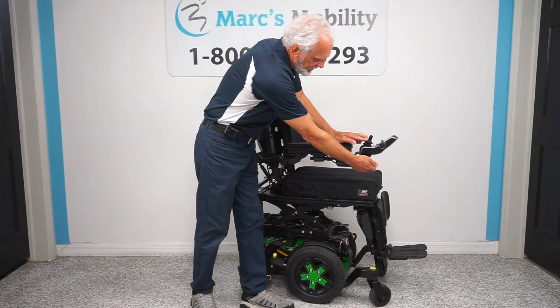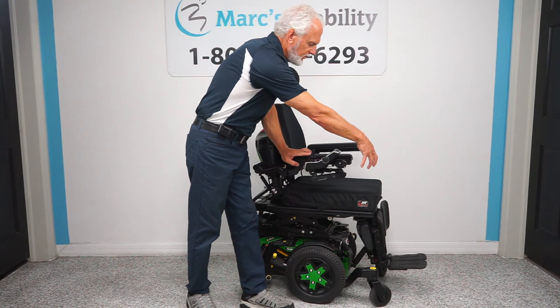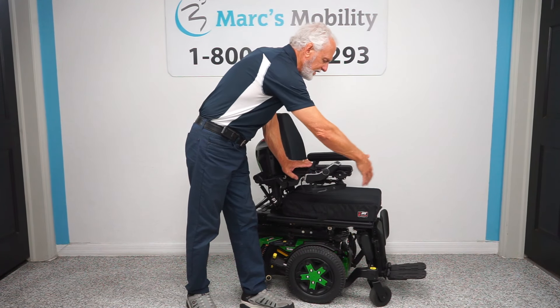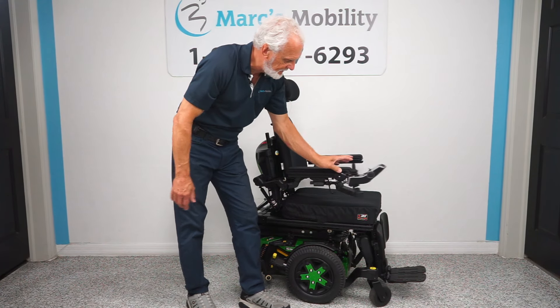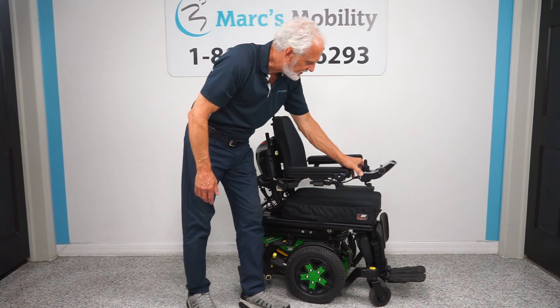While the seat's going down, let me show you this — it's called a swing-away joystick. It takes the joystick from here and brings it over here so you're able to get closer to a dining table without hitting your joystick. If you're left-handed, we can put the joystick on the other side with no problem.